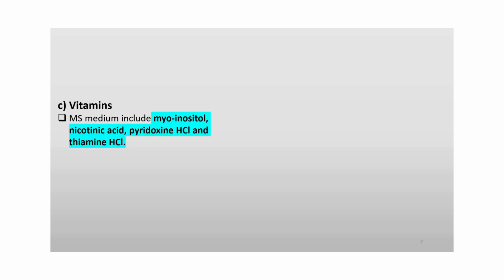Vitamins. MS medium includes myo-inositol, nicotinic acid, pyridoxine hydrochloride, thiamine hydrochloride.